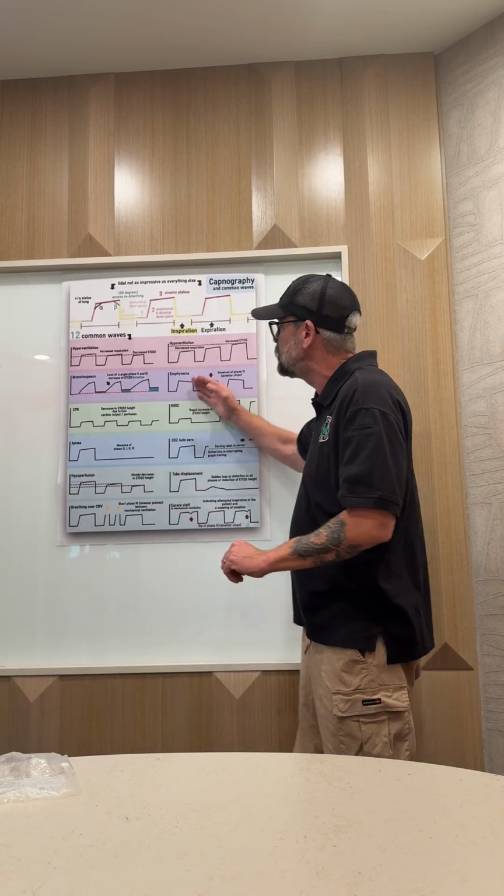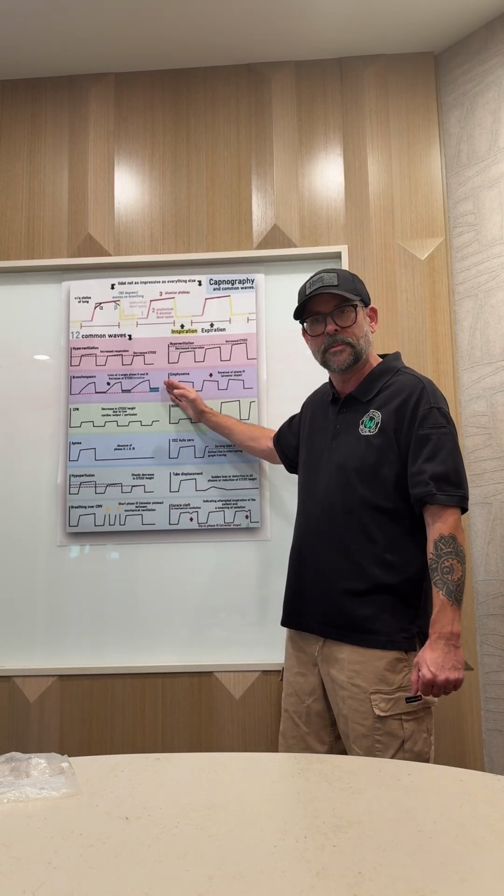We are going to be able to tell so many things just by watching the capnography waveforms.